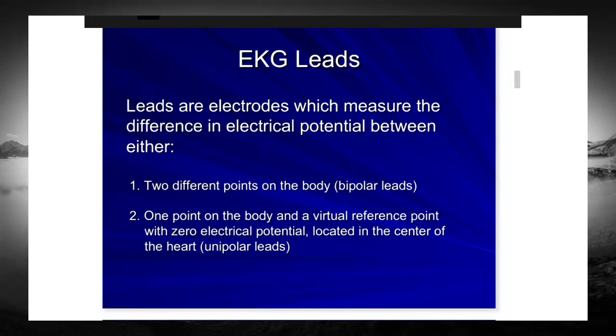So do you know where we put them? Chest area. How many we put on the chest area? 6. Perfect. So that's V1 through V6.